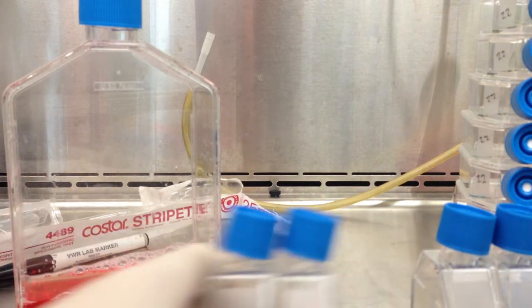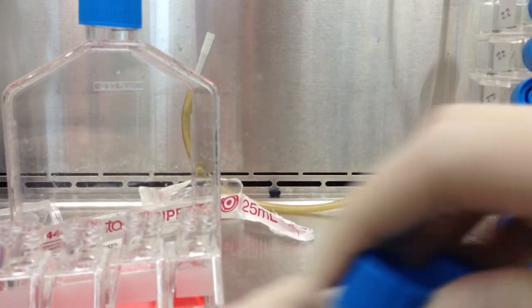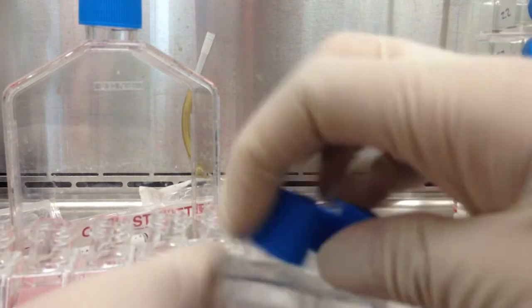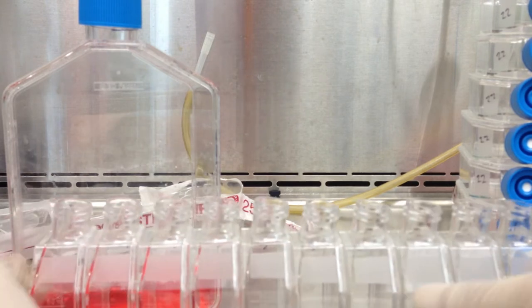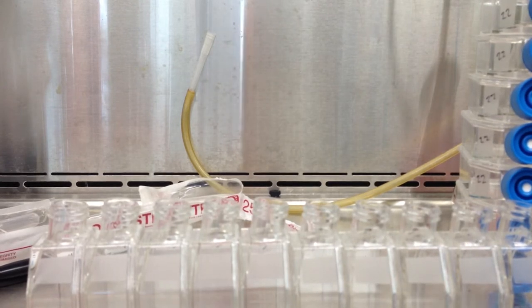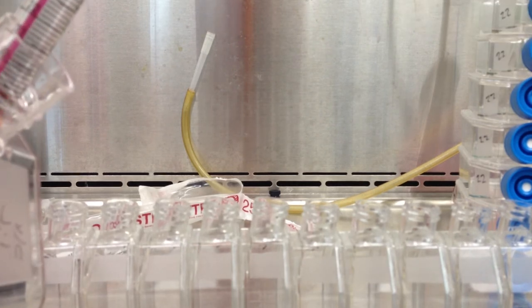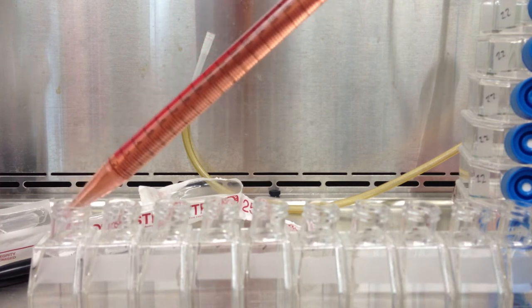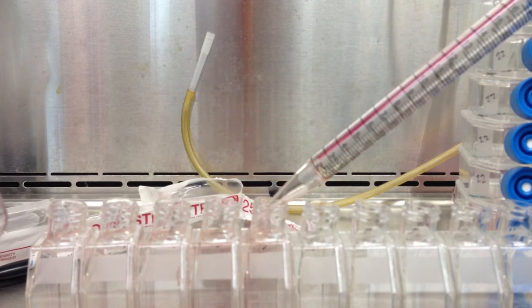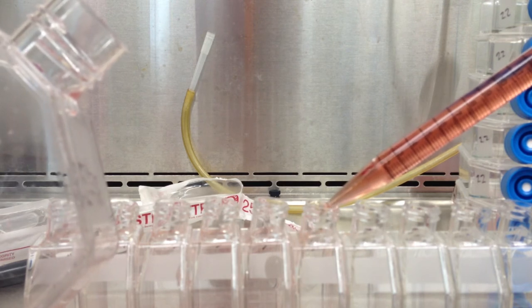And then start the process again. Take off all the caps. For all intents and purposes, I'll just be showing the one flask because I think it'll have gotten to 20 by now. And drop to 25. 5 here. 5 here. There we go. I am dripping a little, so that's not good.